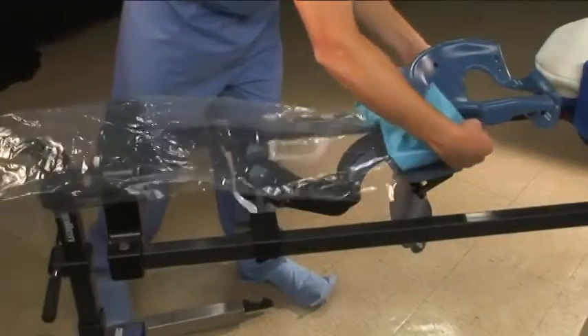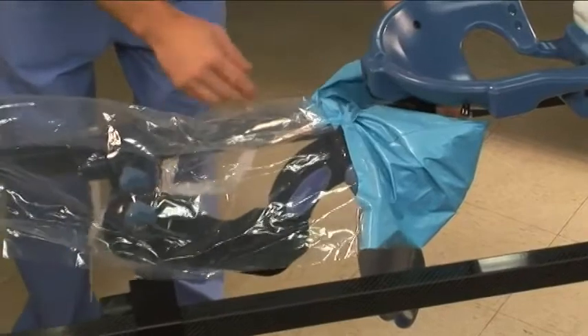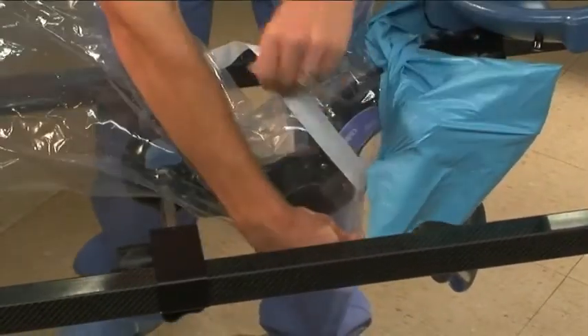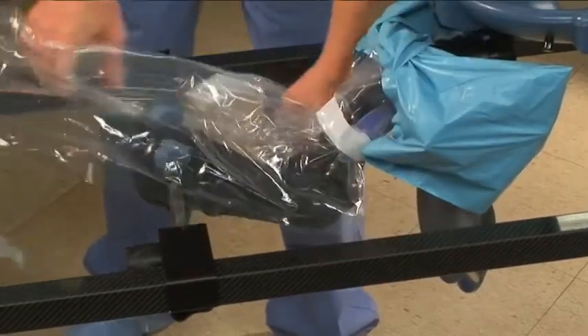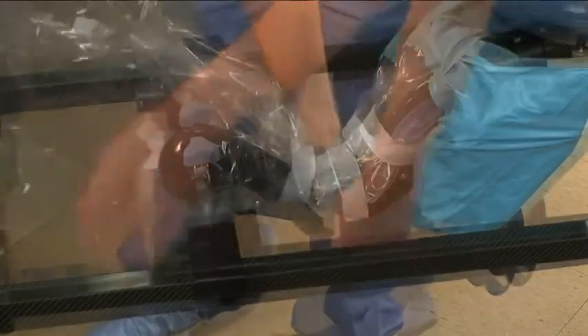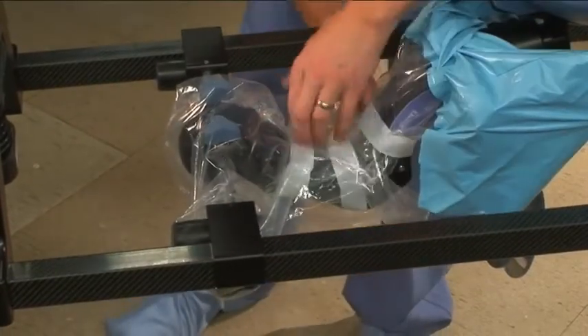The C-flex should be covered during procedures to keep contaminants from getting inside. The clean cape disposable was specifically designed for this purpose. Fit the blue pockets over the C-flex handles and drape the cape over the arm. Wrap the cape around the arm and secure it with the first three white straps. Wrap the cape over the end of the arm and secure it with the fourth strap.